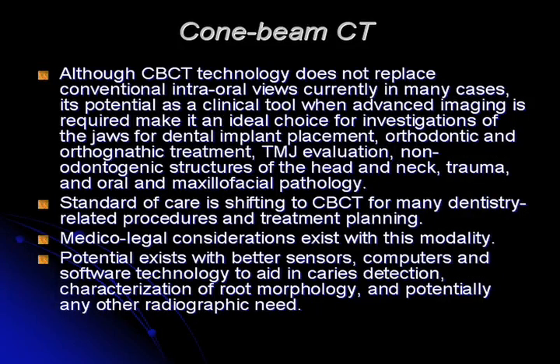As I discussed, once you take these images, whether you're doing it for dental implant placement and treatment planning or orthodontic treatment planning or just to look for a certain pathology because there's swelling or patient has symptomatology, once you take these images, it's pretty much incumbent to evaluate the entire scan and the entire volume. This is how medical radiology works. If you were to get a head and neck CT scan, a medical radiologist wouldn't just look at the area where the pathology is supposed to be. They will look at the entire volume. They'll look at the entire scan diligently and sit there for at least a few minutes and look at the entire thing to make sure everything else looks fine.